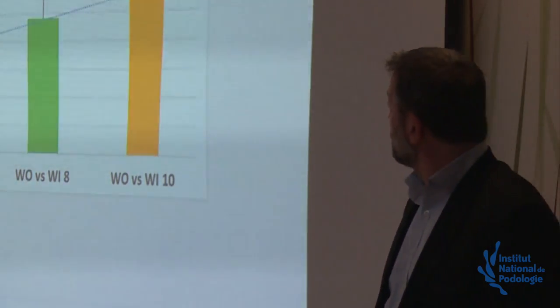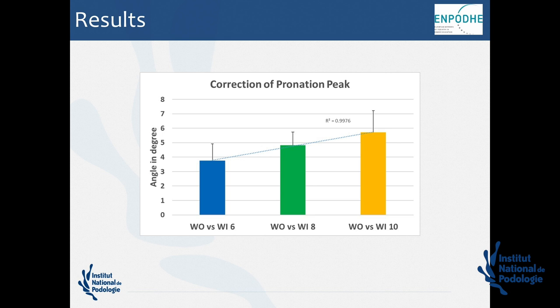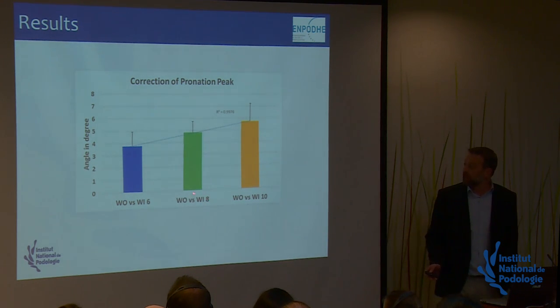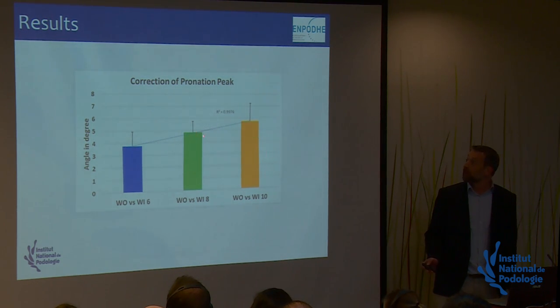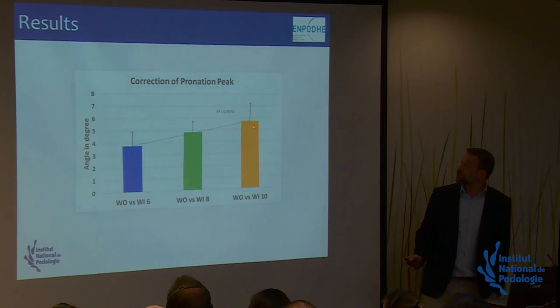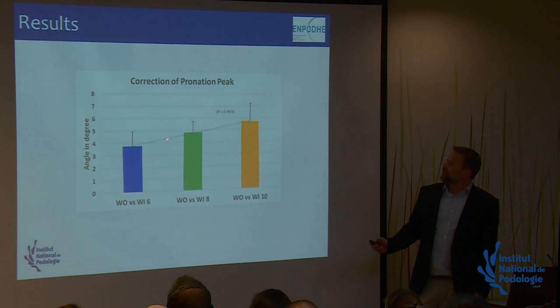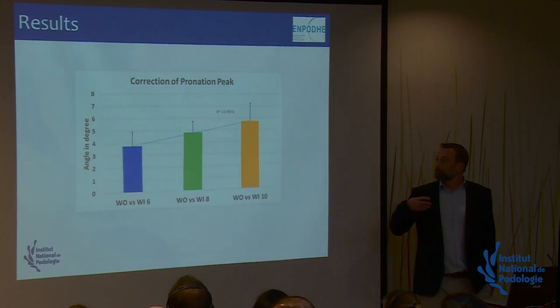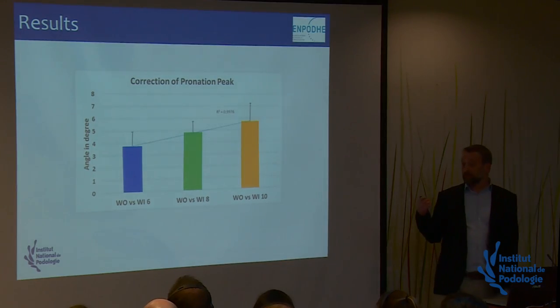So, what correction of pronation peak? Without orthosis versus with 6 millimeters, we get a correction of pronation peak of between 3 or 4 degrees. Versus 8 millimeters, we got a correction of about 5 degrees, and with 10 millimeters, we got a pronation peak correction of about 6 degrees. What's interesting is that there is a linearity. It means the more forefoot slope you have, the more you will correct your eversion peak.